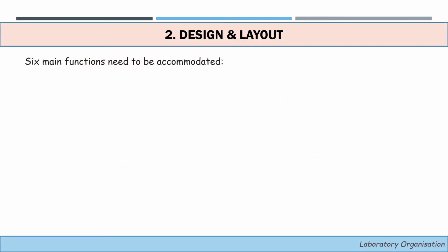While setting up an animal cell culture lab, we need to ask certain questions, like how many would be working in the lab and for how long? What is the scale of the work to be done? How much space would be required for each facility, like the culture area, preparation area, wash-up, storage, etc.? Answers to these questions determine the design and layout of the laboratory.